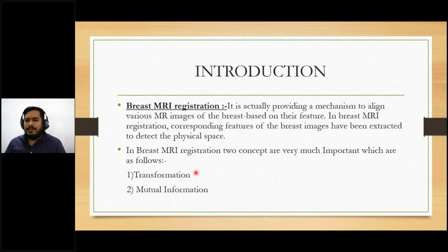Now I am coming to the introduction part of my research work. Before I talk about the content in a detailed manner, first of all, we need to understand what breast MRI registration is. It is a mechanism to align various MR images of the breast based on their features. In breast MRI registration, corresponding features of the breast images are extracted to detect the physical space.